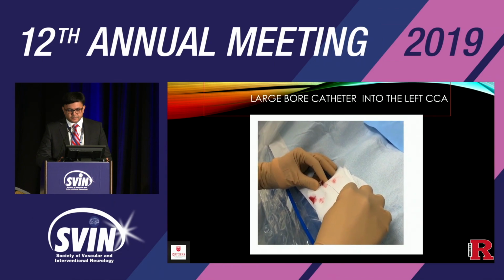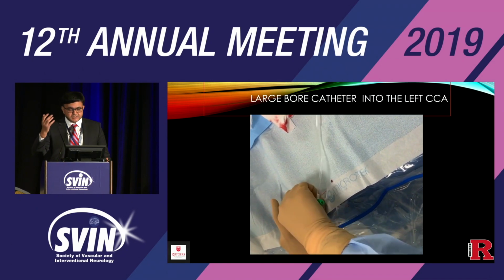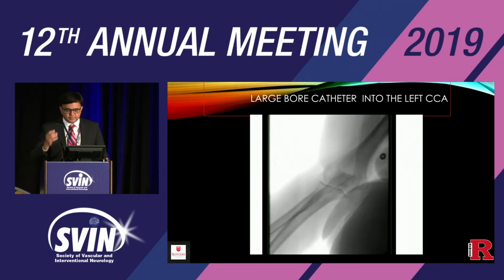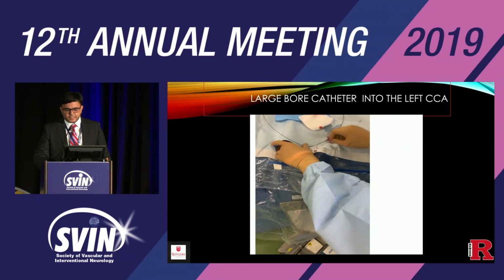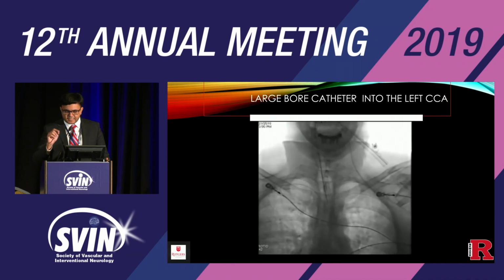So this is our fellow getting the access. He's putting the wire. It goes smoothly. We put in a 6 French sheath. You can use a 7 French slender sheath from Terumo. I always do an angiogram to see what's lying ahead. Our J wire is going up. And you see the Infinity with its introducer. It may get stuck a little bit at the skin. You may have to nick it a little bit.